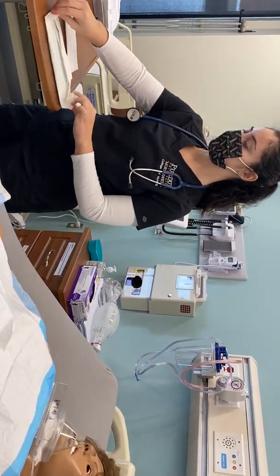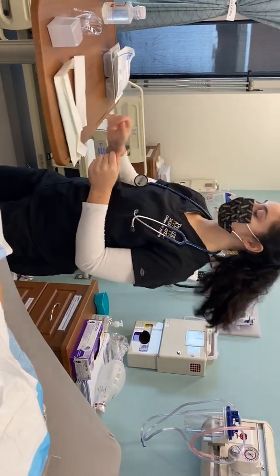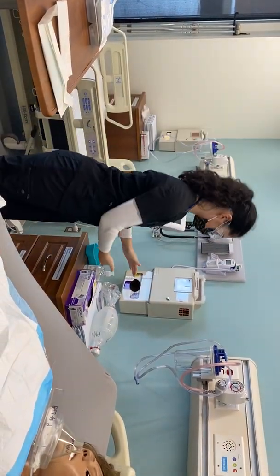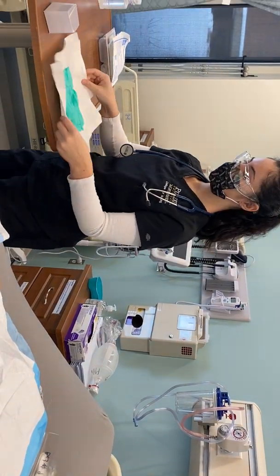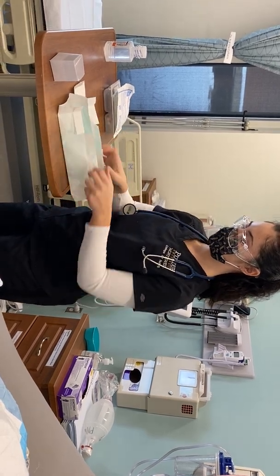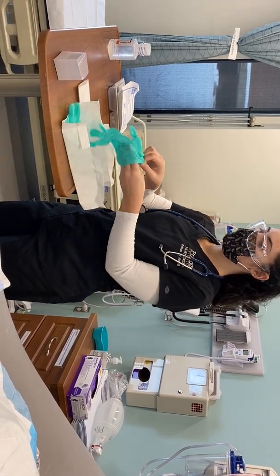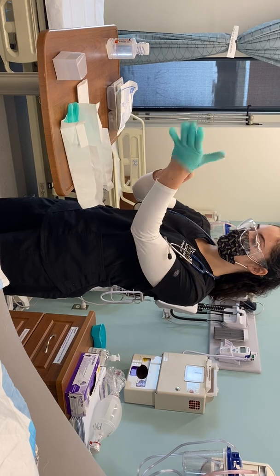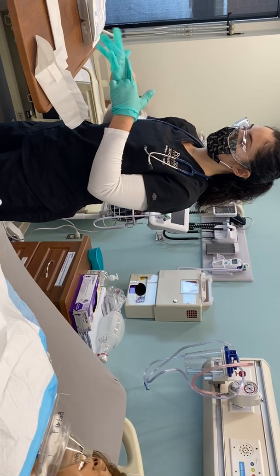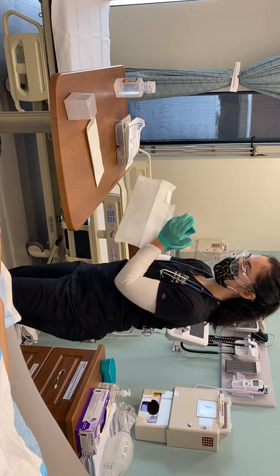Okay, now I'm just going to, okay. You're doing okay, Mr. Jackson? All right. Do my PPE and my gloves. Put my sterile gloves on. I would do this without contaminating the sterile gloves, as I might have just done. Throw that out.